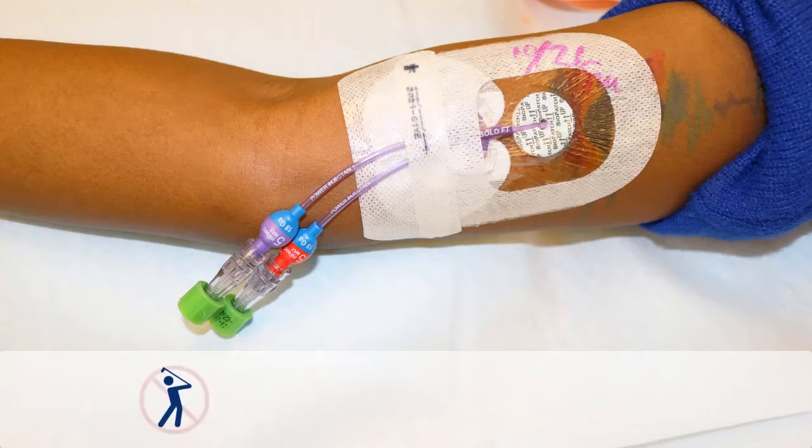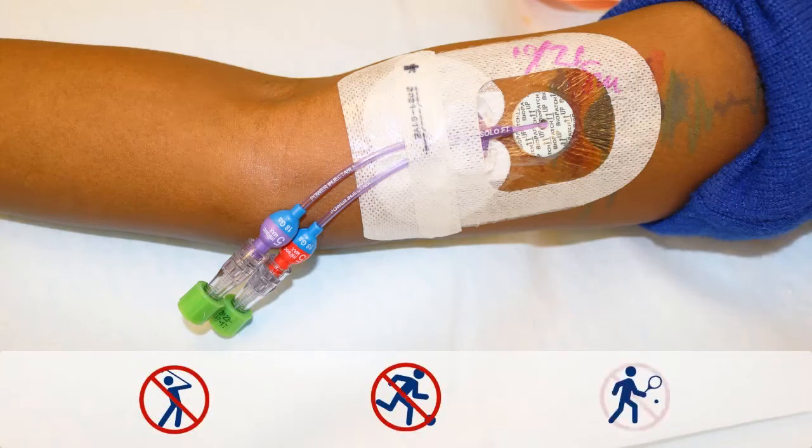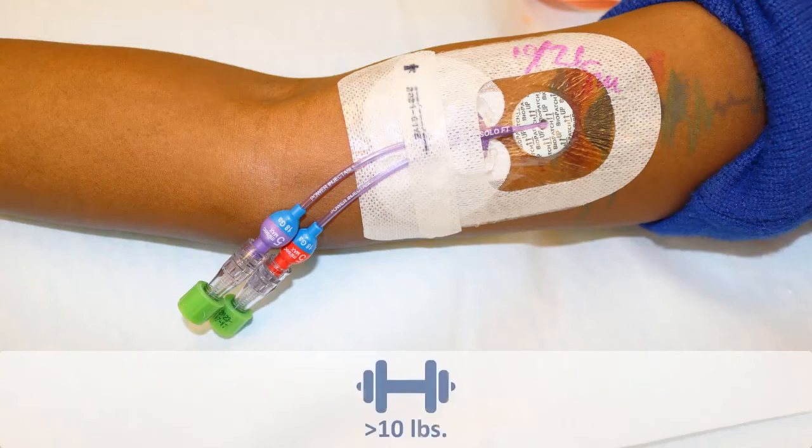In order to prevent damage to your PICC, you should avoid using the involved arm for any strenuous activity. Routine activities can be carried out if the PICC is properly secured. Do not lift anything over 10 pounds with this arm.